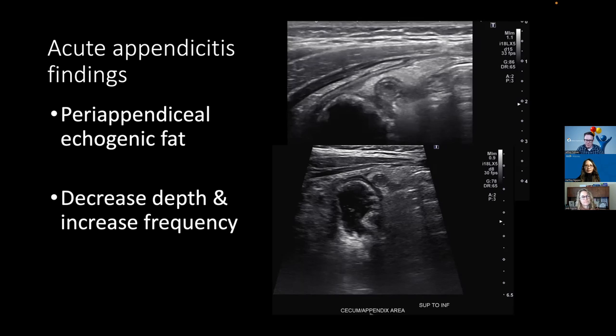I think it's had benefit beyond just giving the techs practice looking for it. It gives us a baseline of what the distal small bowel looks like. And if we can see the TI and the ileocecal valve, that also helps localize the cecum and then we can start our search for the appendix there. So I think that's had some value for us. Specifically including the terminal ileum increases our confidence that if we see a separate appendix, we can more confidently say that it's actually the appendix and not small bowel.